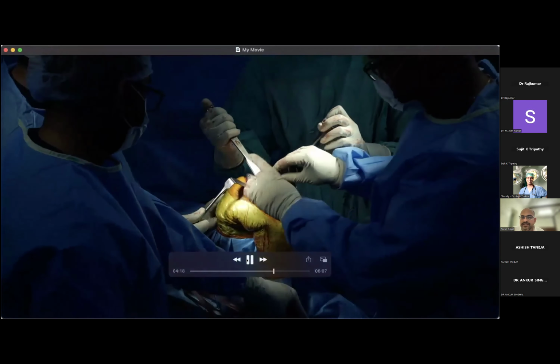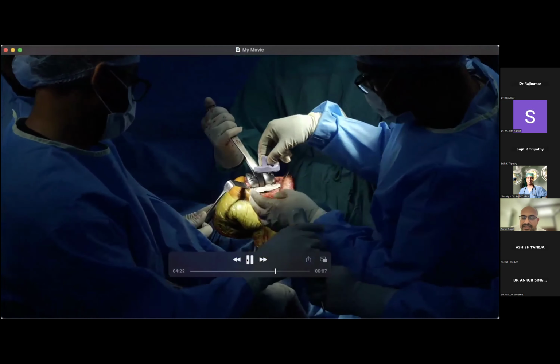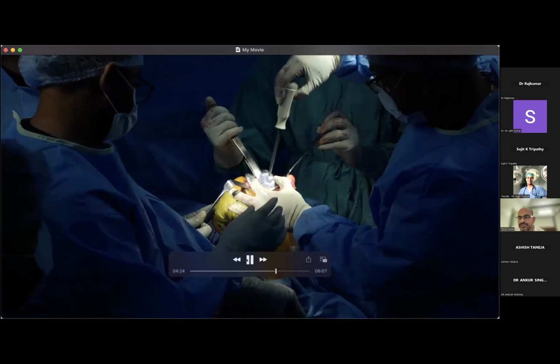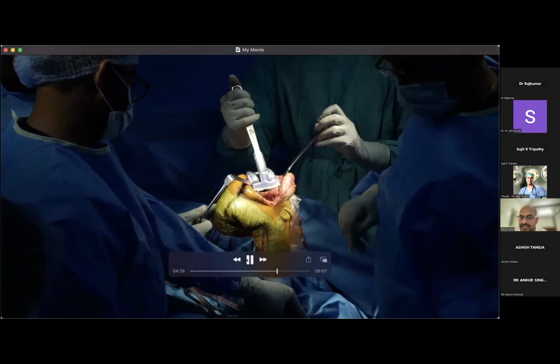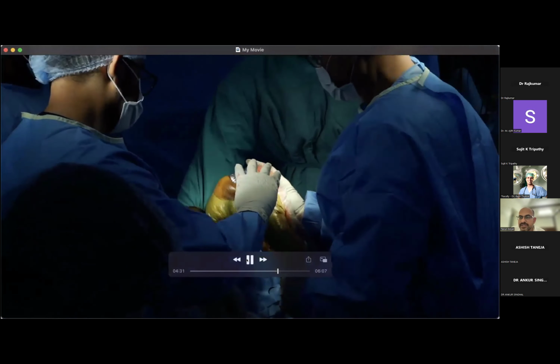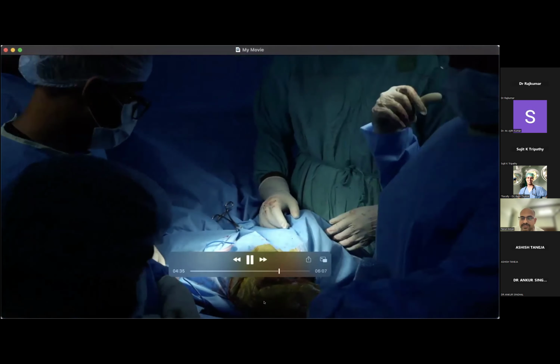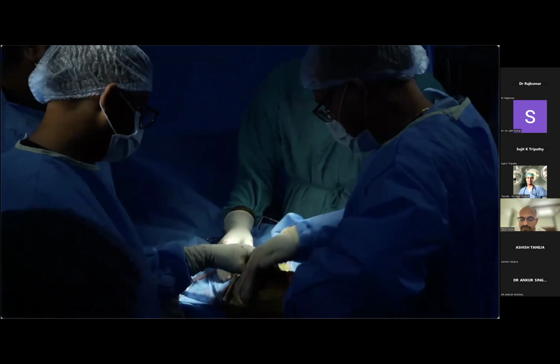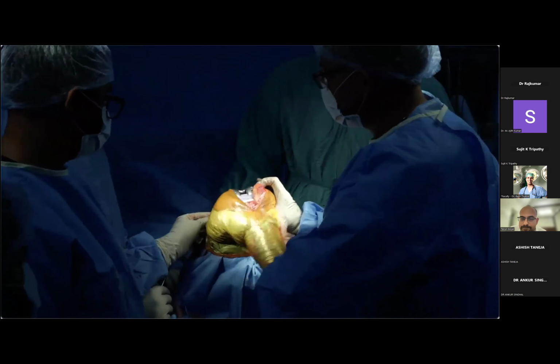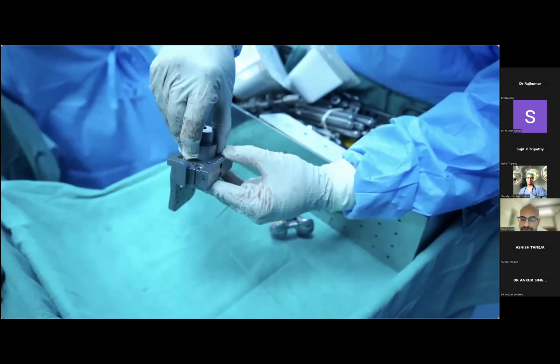The tibial trial and the femoral trial have been put in place and secured. Again, we are going to measure the flexion and the extension gaps, and as was needed in this case, we'll scale up the poly insert if we don't find the stability is good enough for us. The flexion and extension gaps should be matching. There should be no recurvatum.